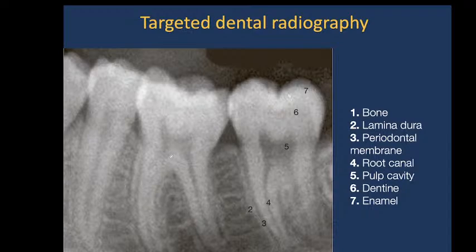When they need more detailed structures, they try targeted dental radiography. Especially they use different power of the X-ray, and see separated dens to examine their radix, crown, and even the cavity inside of the dens.